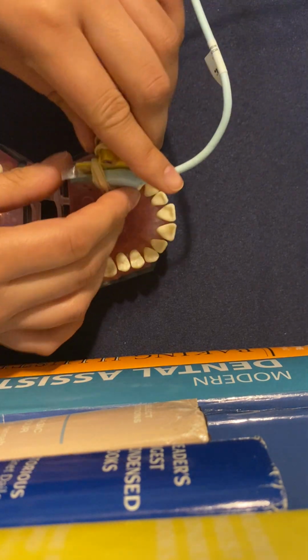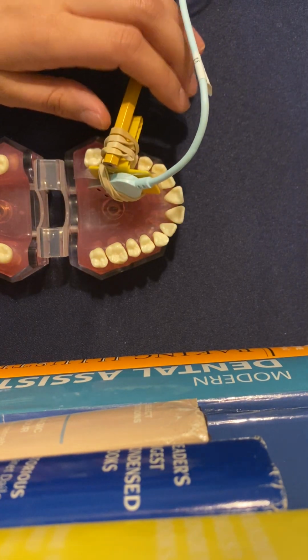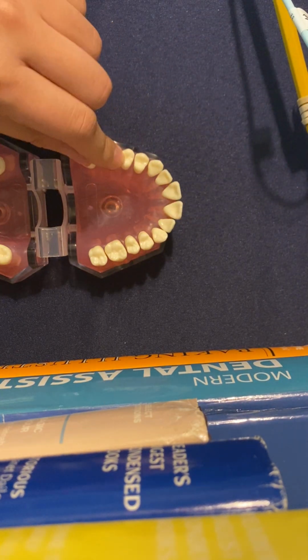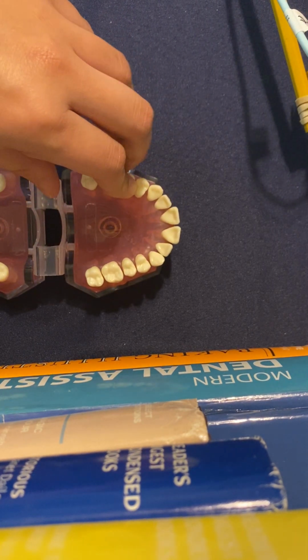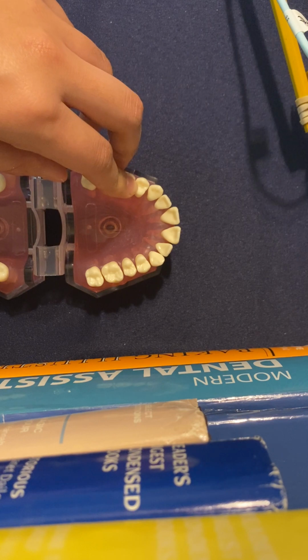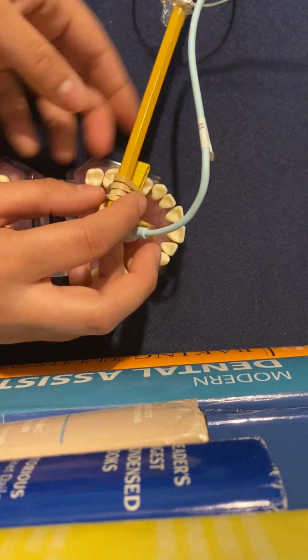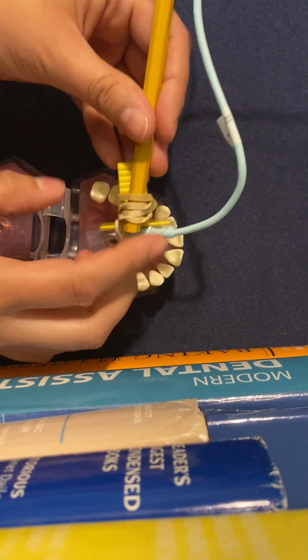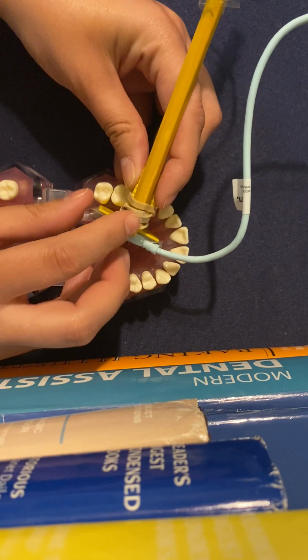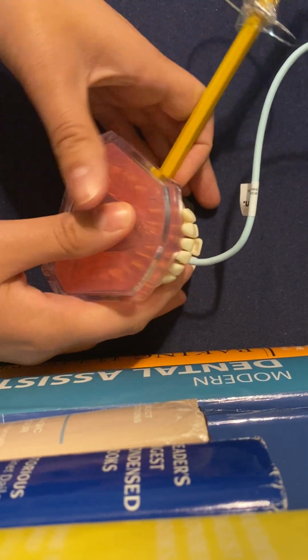Sorry, it came off a little bit. Alright, so you're going to want to center it on the second premolar. I'm just showing you with my hand. And the teeth you're going to want to see are the distal of the canine, the first and second premolar, the first molar, crown, and apices. Midline, getting that sweet spot. Try to make it parallel as much as you can with the teeth. And bite down.